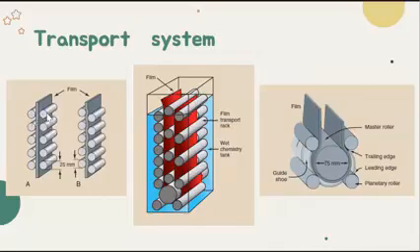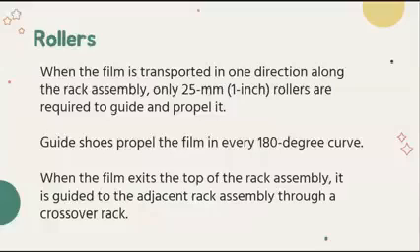Okay? So when paired with each other, the transport goes straight through. With the offset, the position of the rollers is like a window pattern. These are the two types of transport racks, either with pairs or offset from each other. So each transport roller, which is the basic roller, is 25 millimeter in diameter.